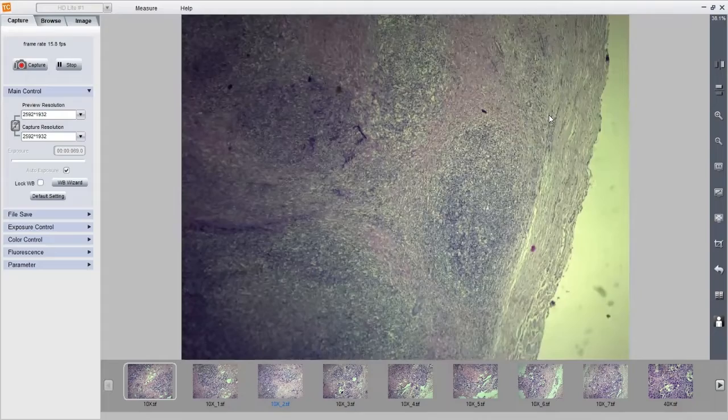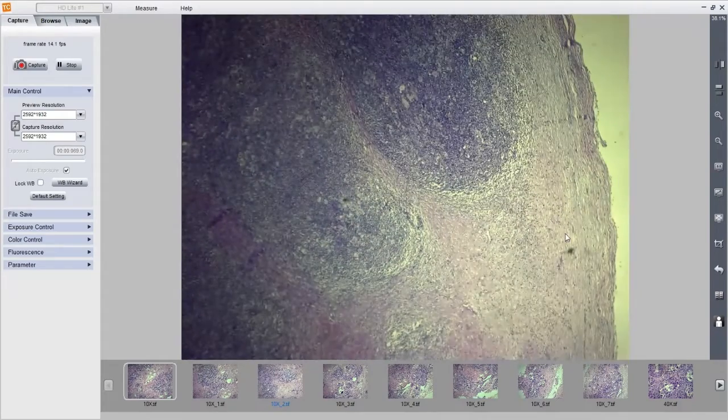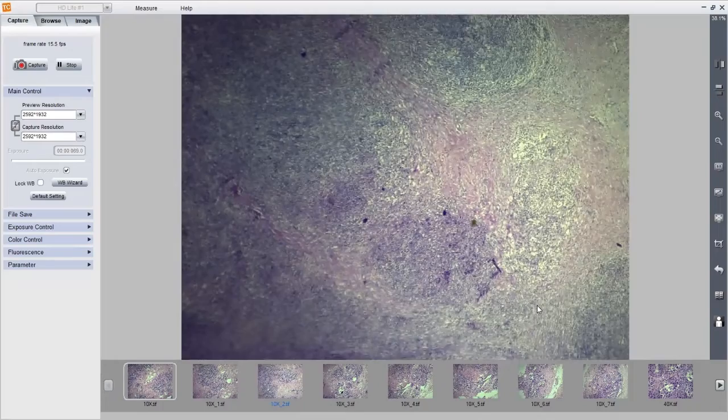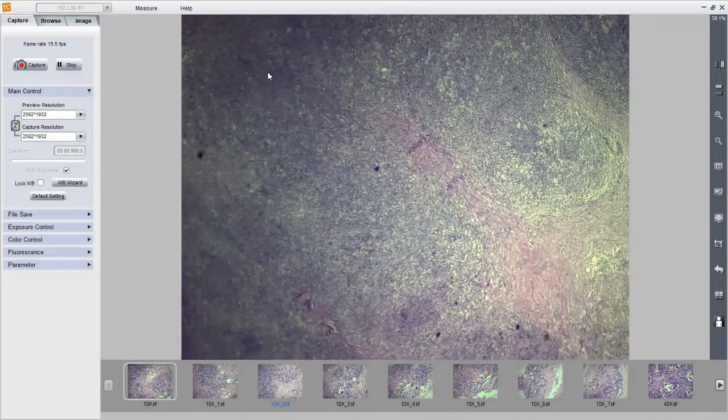And now what do we see here? This capsule is going in like fibrous septa, and there are some big nodules out here. Remember, this is still the scanner view. We have not gone into high power. So this capsule is going into fibrous septa, and we are getting so many nodules. Is the nodularity visible for everyone? Large nodules separated by fibrous septa.